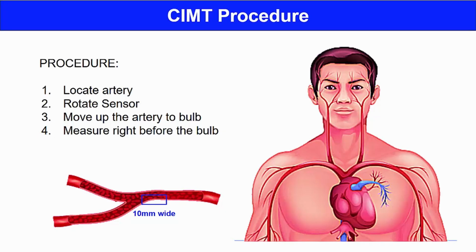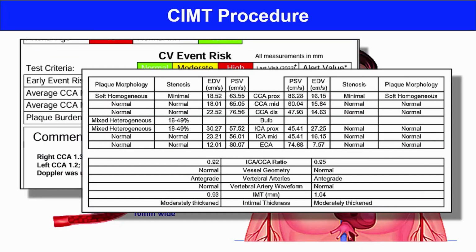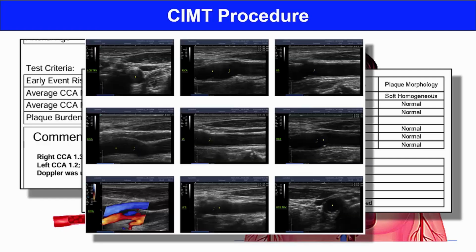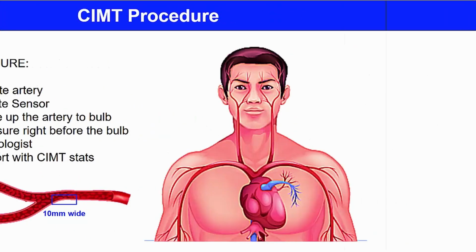And of course, we repeat all of that for the left carotid artery. Those results are then sent to the radiologist, and then you get a report summarizing all of this with some numbers indicating your peak and average intima media thickness values. Some companies even provide still images of your arteries. We'll take a close look at those reports in a separate video. Okay, now that we have a solid conceptual understanding, we're ready to see the real thing.